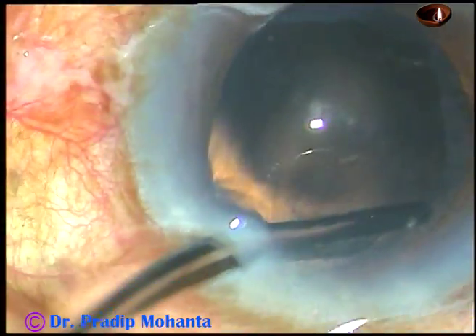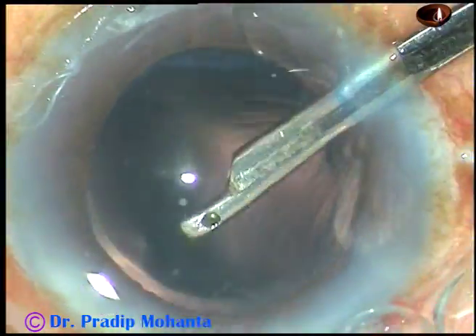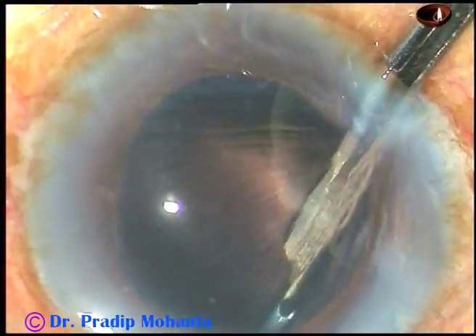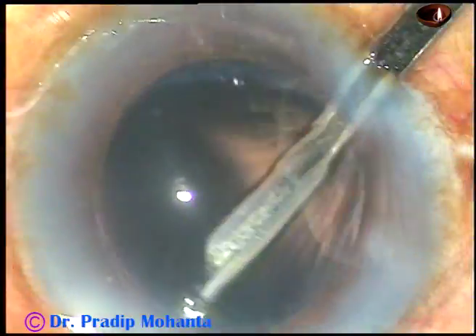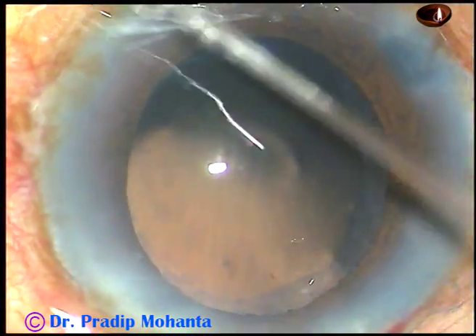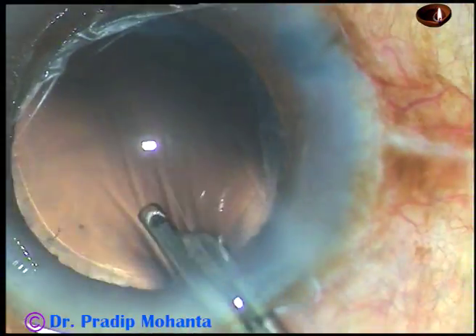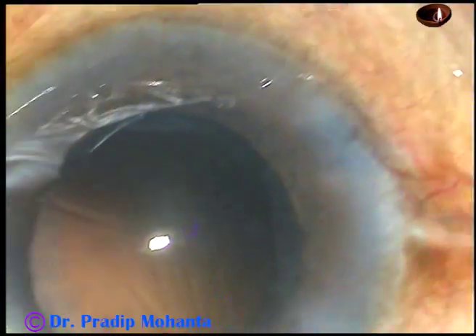Cortical cleanup is almost done. There are some cortical matter in the sub-incisional area, and that has been removed. The posterior capsule is quite clean now and it doesn't need further polishing.